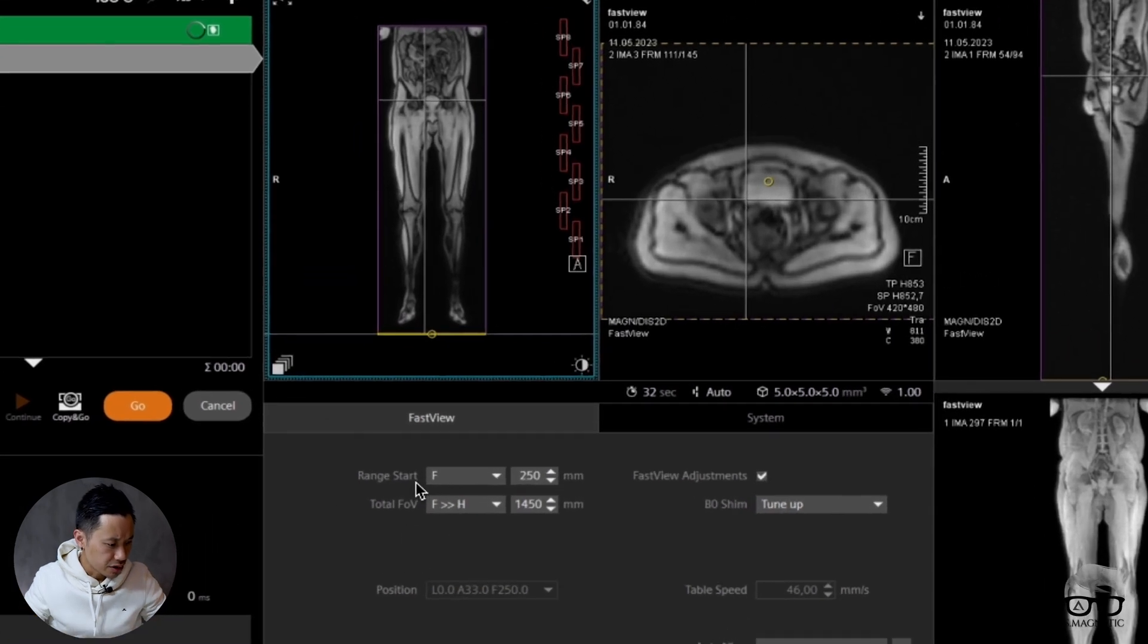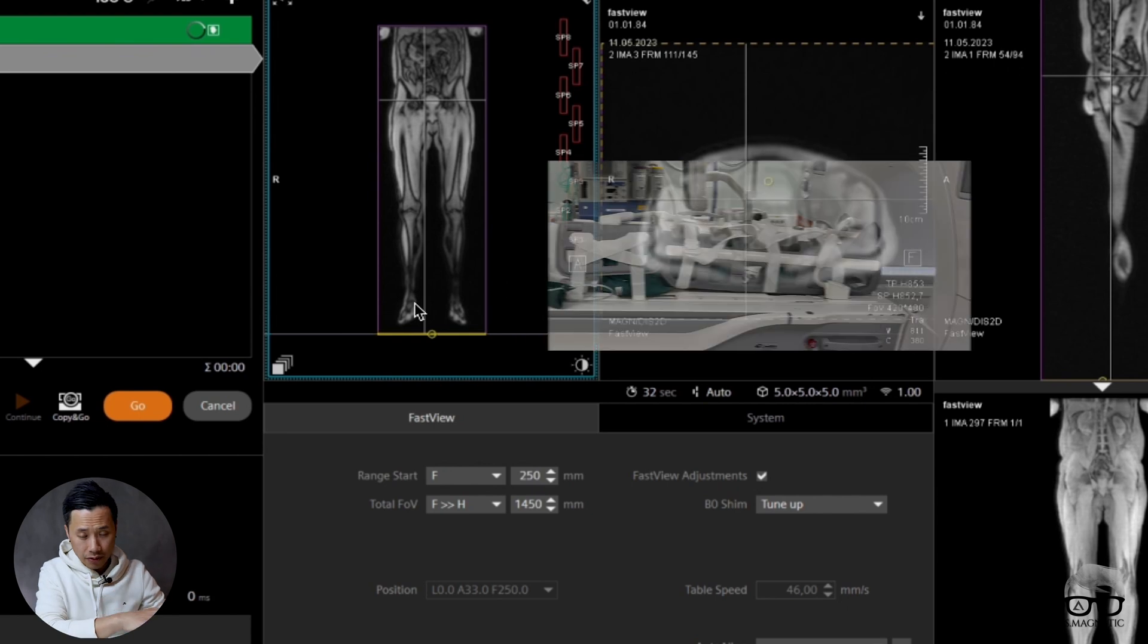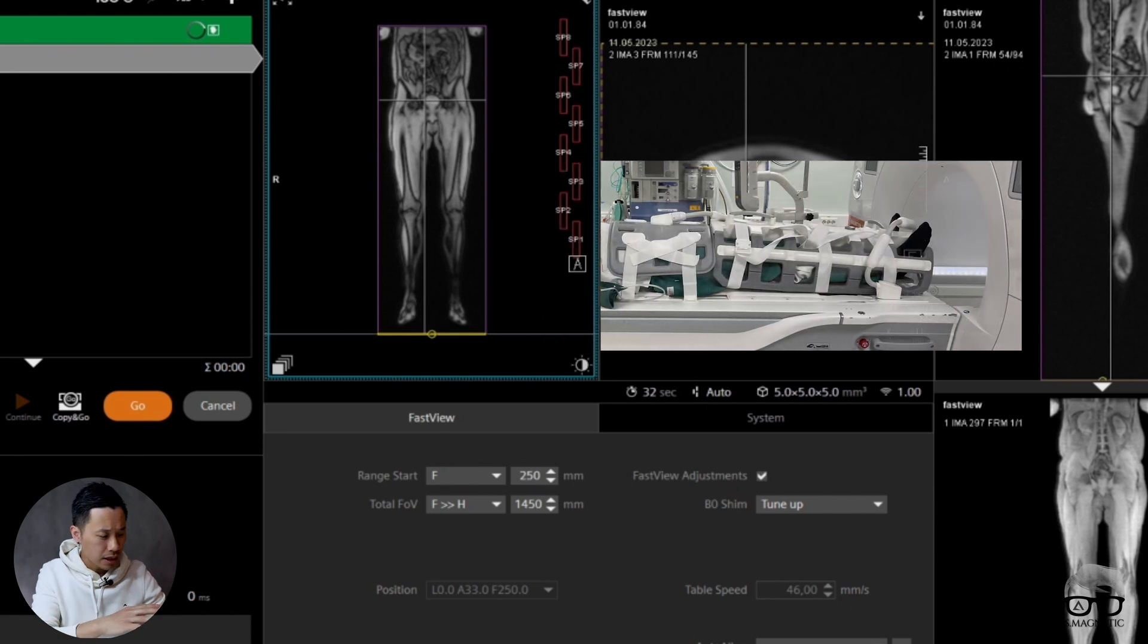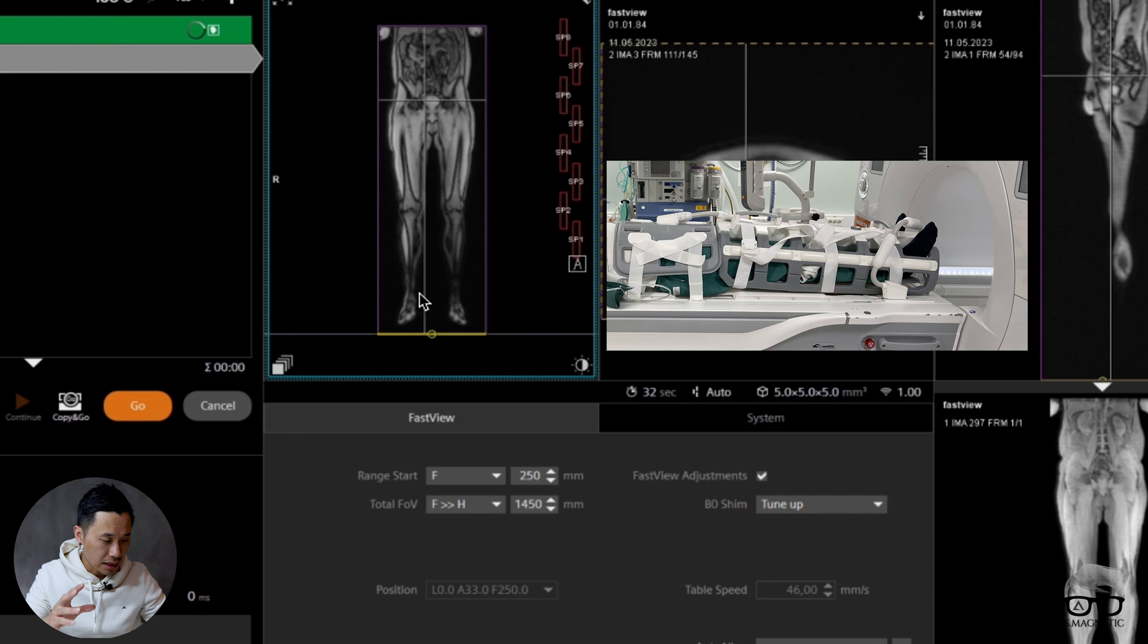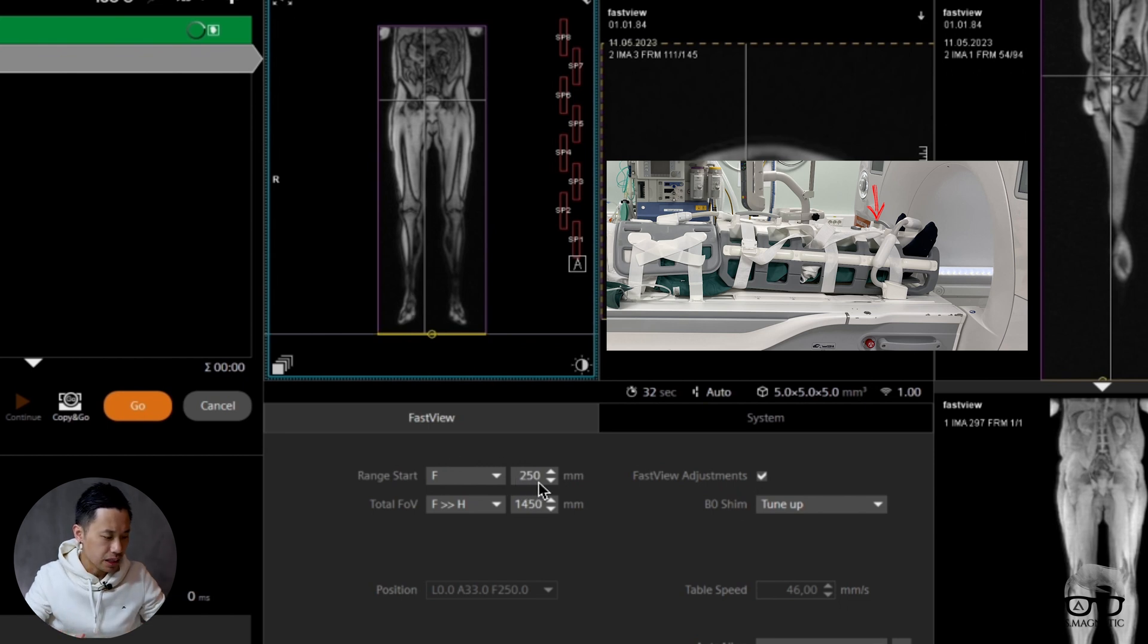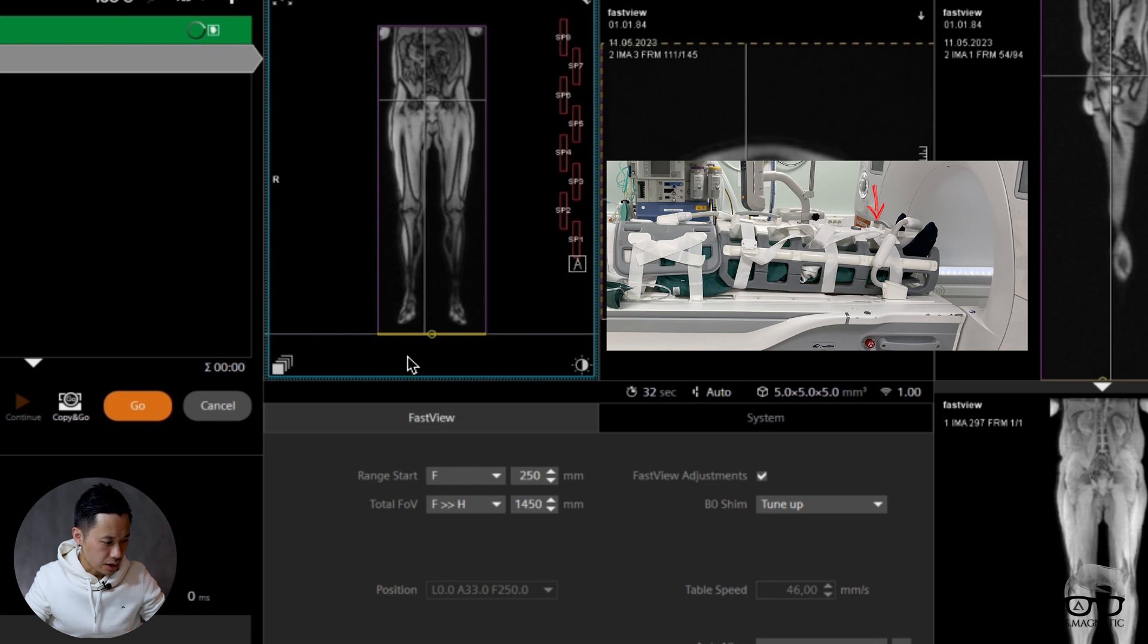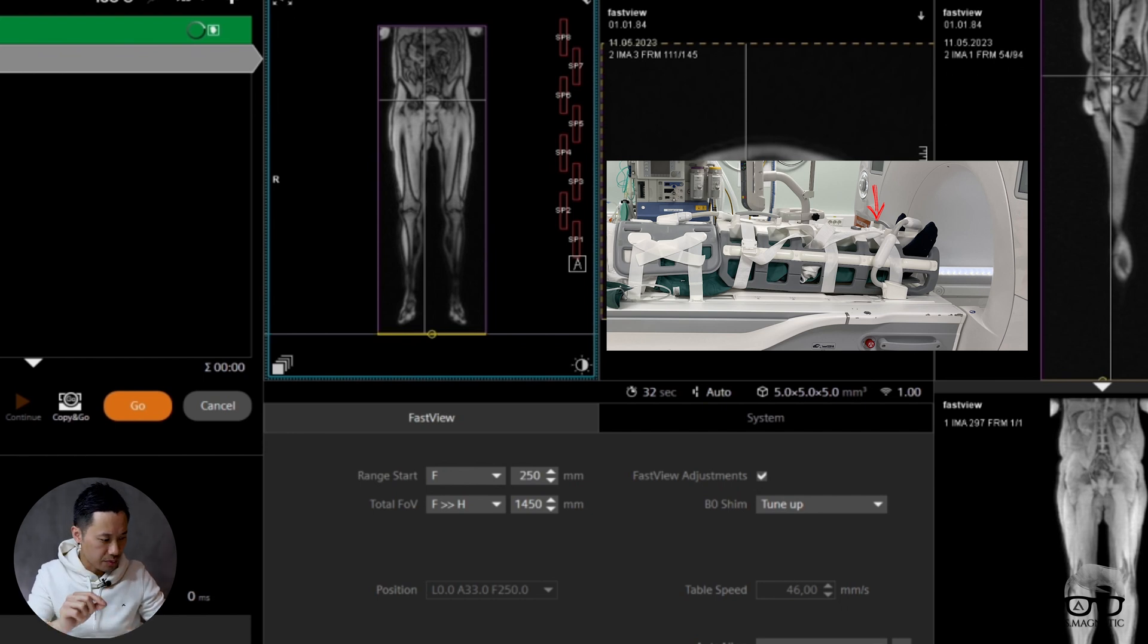As you can see here, the range is FH 250 millimeters. That means feet first, and I had the ISO center around the laser light. Whenever ISO center is right there, it starts toward the feet 250 millimeters, so it starts around there. That's what is meant by the description whenever you're taking the protocol.